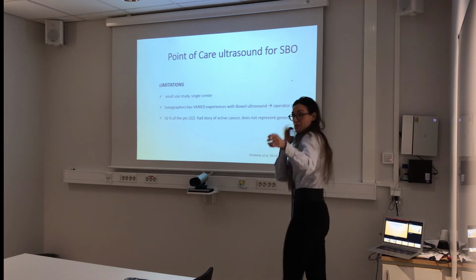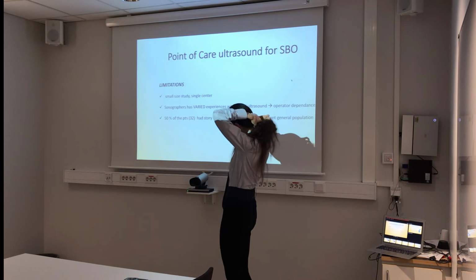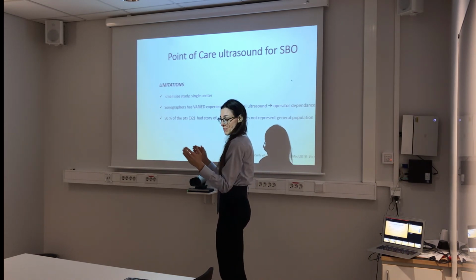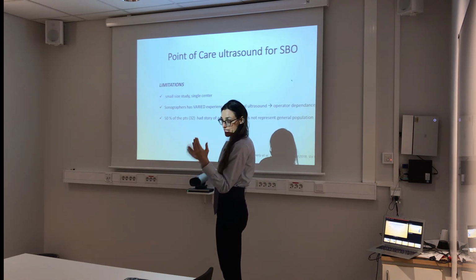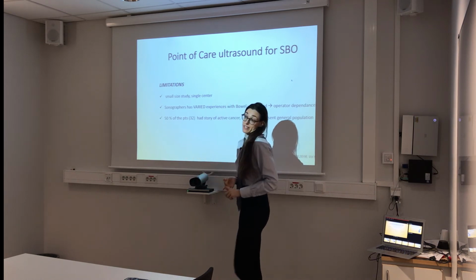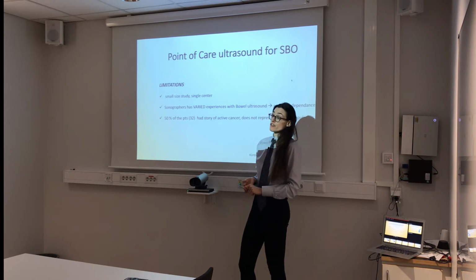Limitation, again, the limitation, as you just pointed, is that group that was indeterminate, which is a bias for the point of care ultrasound. By the end of the day, whether the sonographer did or didn't have the point of care ultrasound, we don't know. Another limitation is a single center study. Another limitation is the capacity of the sonographer.